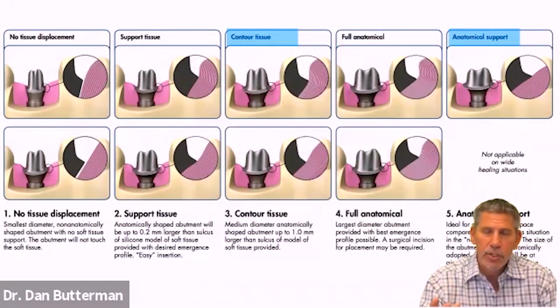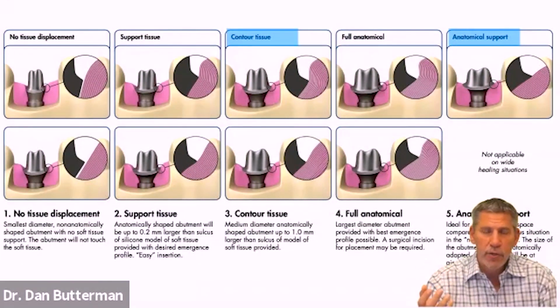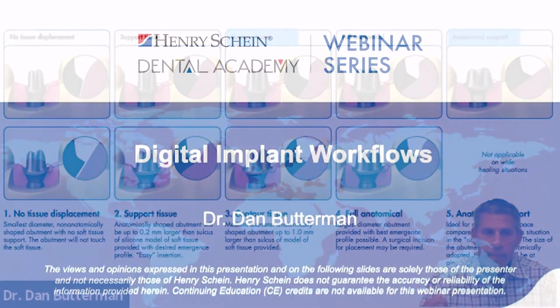I like them very, very much, and they work incredibly well, but your processing has to be perfect. You have to clean them properly. You have to photo cure them properly. If you leave a little excess resin or cure them inappropriately, then the guide hole can shrink and you can have fit issues. If you haven't calibrated your resin, you can have issues. So it is an incredibly accurate process that I use all the time in my practice, but I have to pay closer attention to make sure that the fit and the accuracy is going to be there, whereas milling is typically a no-brainer. There's nothing to do with it.